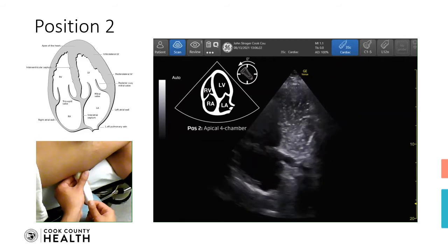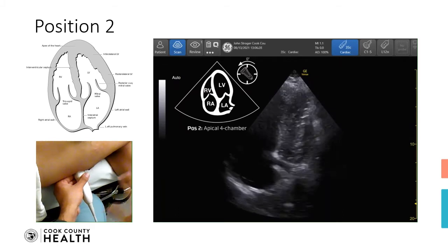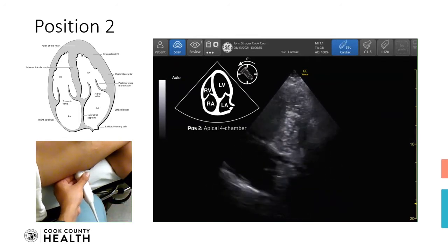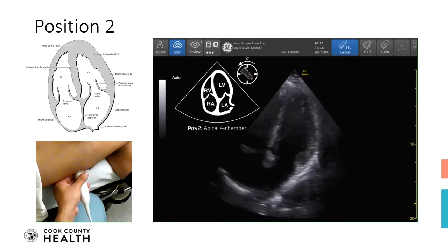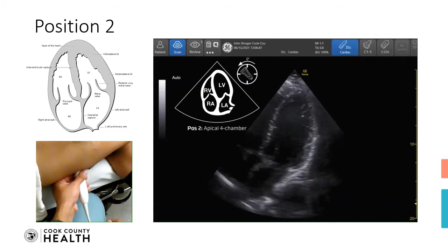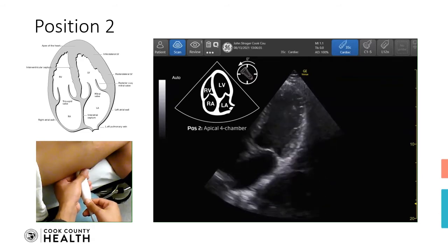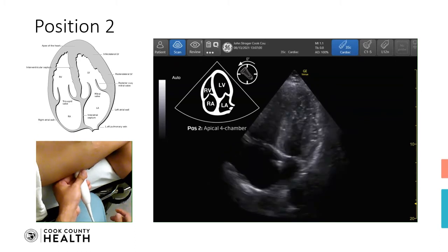The next is to see how motions of the probe can distort the image. What kind of motion can cause what kind of image distortion, and what are you seeing on the screen right now, will depend upon how your probe is moving. So here again we have the 4-chamber view, and tilting the probe left or right is going to cause a rocking motion of the heart left or right on the screen, which we saw in the parasternal views.